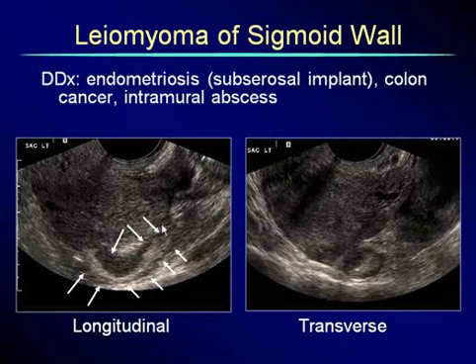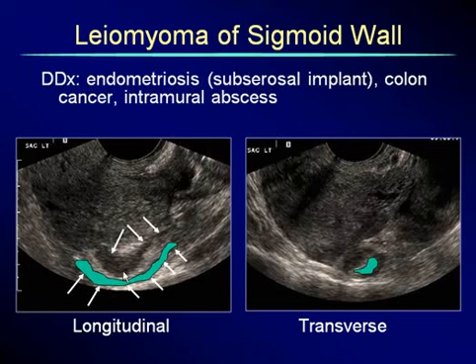Sometimes ultrasound triumphs in making a really good call. This patient had pelvic pain. It was chronic. She had multiple different studies and came one day for this ultrasound. Her pelvic organs were completely fine, but we noticed this unusual kind of hypoechoic structure. As we looked, we evaluated, we saw that there was peristalsis going through here. So the lumen of the bowel is here, where the green is. But the lesion here in orange, as we see, was actually in the wall of the bowel. It stayed with the bowel, but it was in the wall.